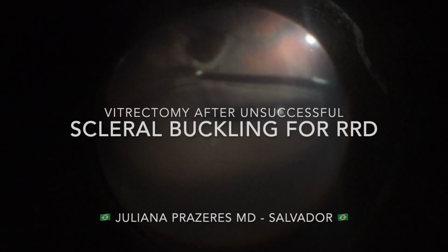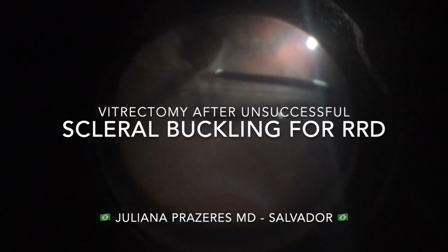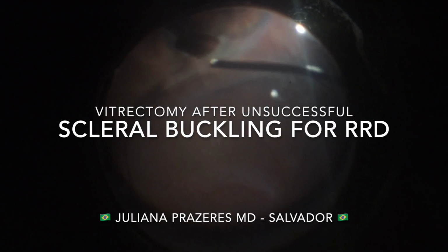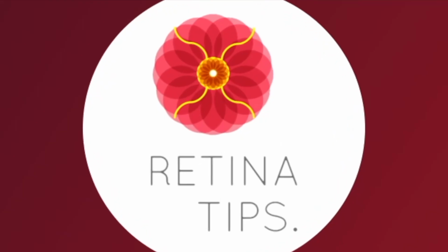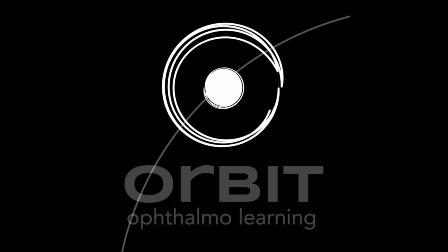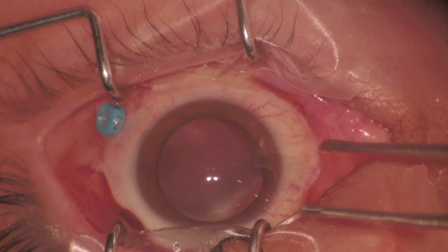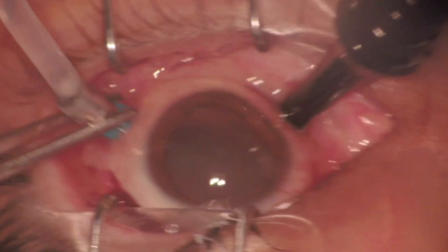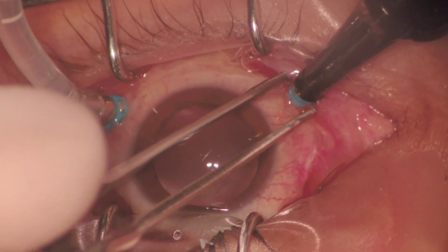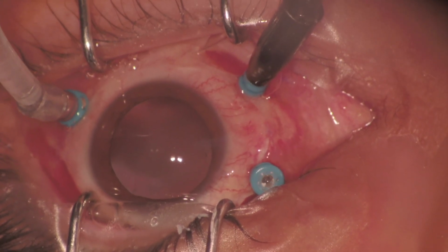In this video, we demonstrate a vitrectomy for the treatment of an inferior retinal detachment, previously submitted to an unsuccessful circumferential scleral buckle. The video, shared by Dr. Juliana Prazeres from Salvador, Brazil, features a 21-year-old patient undergoing a new surgery following the failure to reattach the retina using scleral buckle and cryopexy.